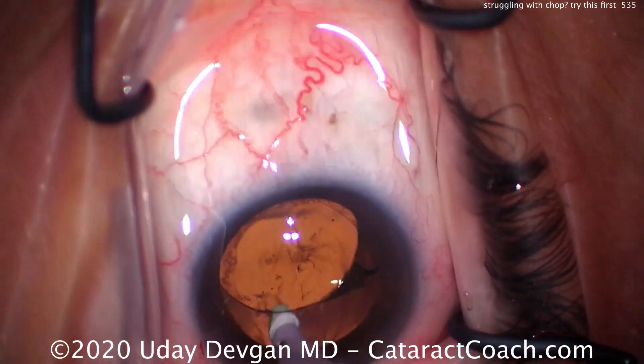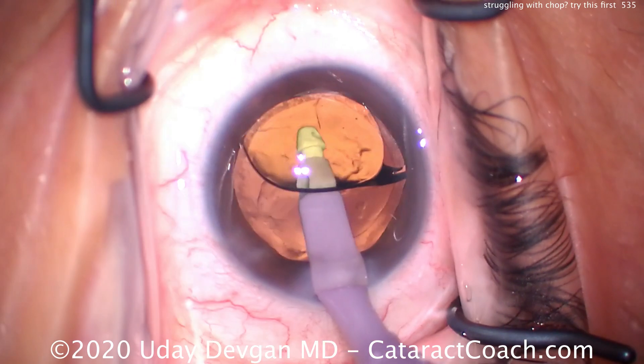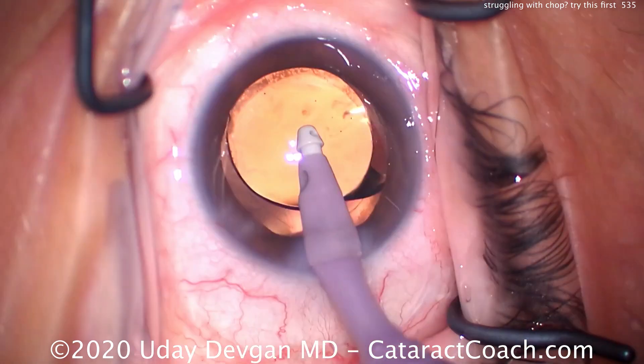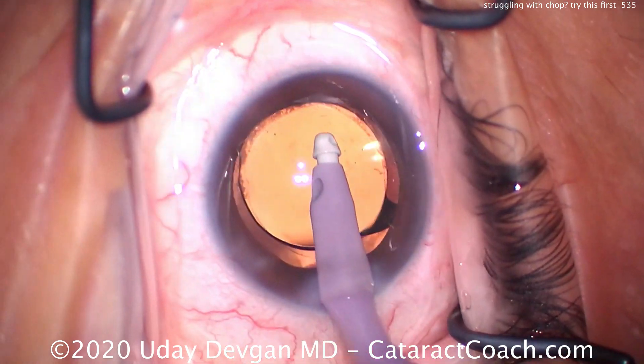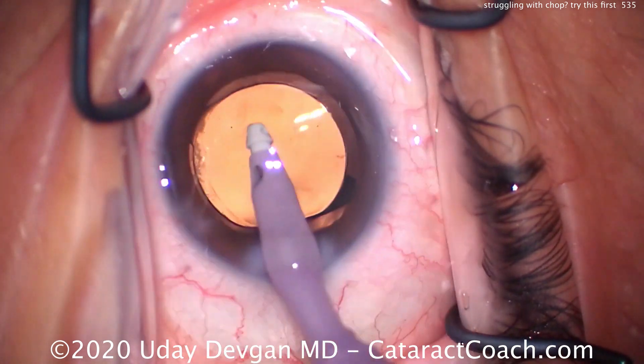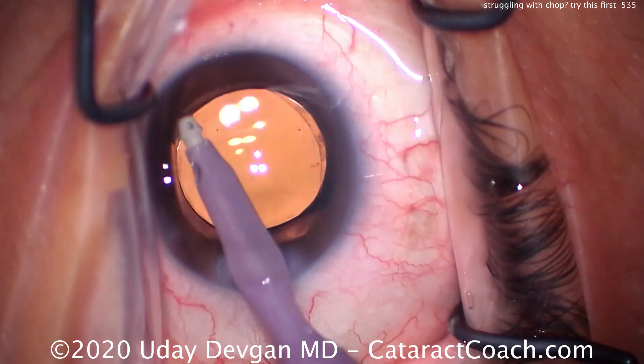It uses a bare minimum amount of FACO energy, a very minimal amount of fluid goes through the eye. It's surprisingly gentle on the corneal endothelium — we're actually not applying much energy in that area. We go beveled down with the FACO probe when we do that.